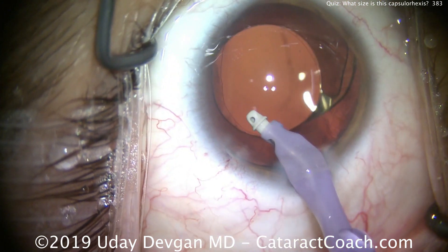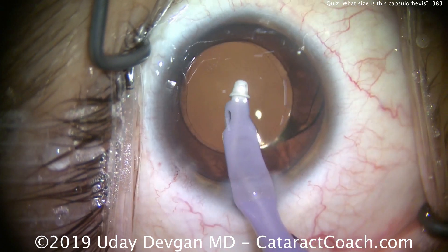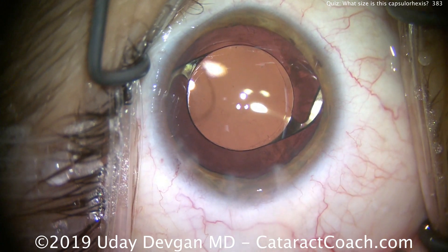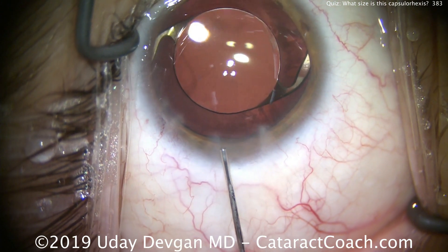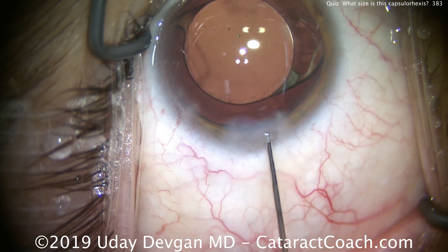This is probably about a 5.5 millimeter capsular rhexis, very well centered — just about perfect for this eye. The lens looks so small because this is a big eye. There are lenses available in the US with 6.5 millimeter diameter for foldable lenses, and rigid lenses up to 7 millimeters.